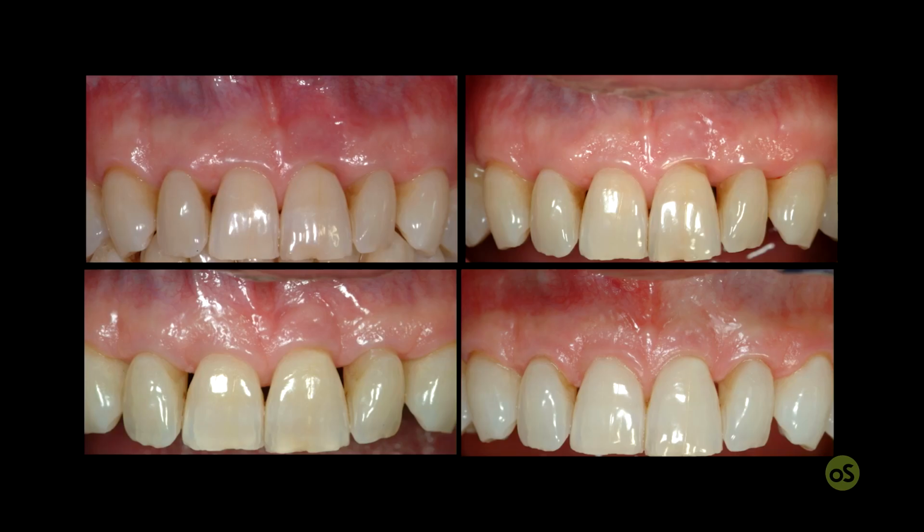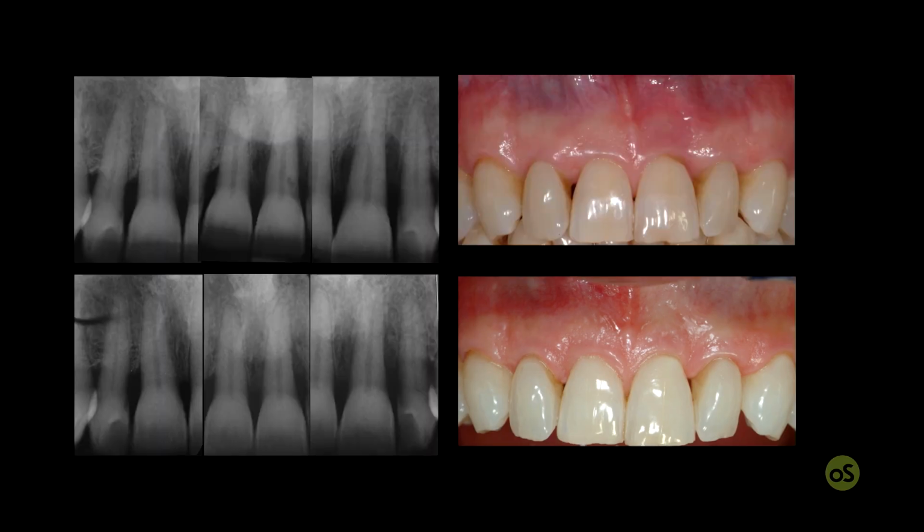But then you coronally advance the flap, you make exactly the same procedure, and you can see this is the baseline, this is the 3-month, this is the 6-month, this is the 1-year outcome, in which you can see that from the beginning to the end, 1 year later, there is an improvement in the soft tissue together with a complete healing of the bony defect.